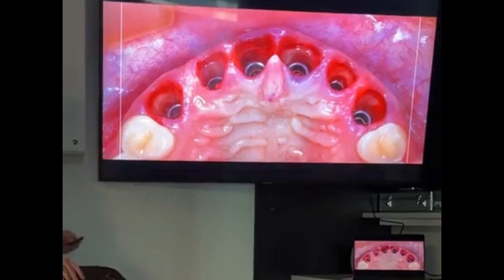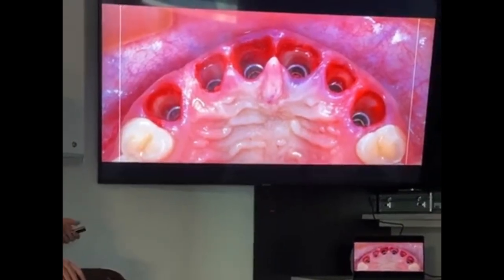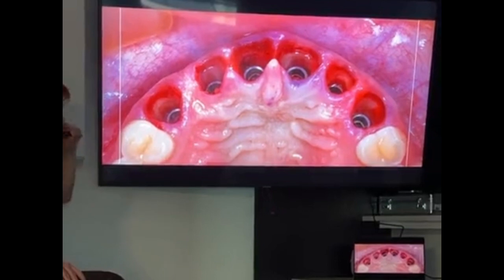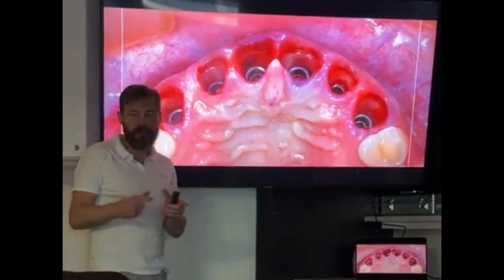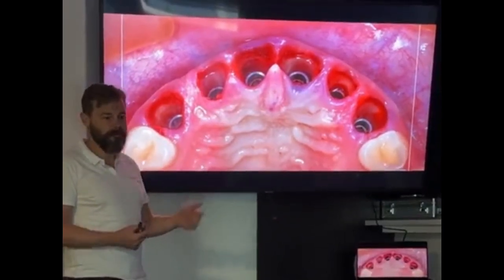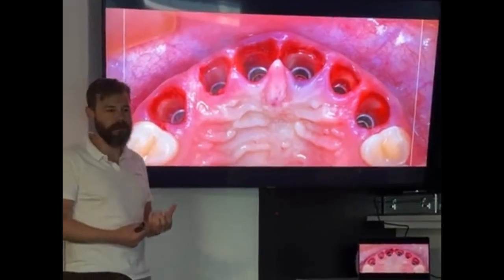Six teeth extraction, right? I know your faces, I know the question: why six implants? But we have been working for a second day now, and as I told you, the way we manage the peri-implant tissue now, this is not a wrong decision. If it was some years ago and you did not manage that, it would completely be a complication that we would be creating in our patient.